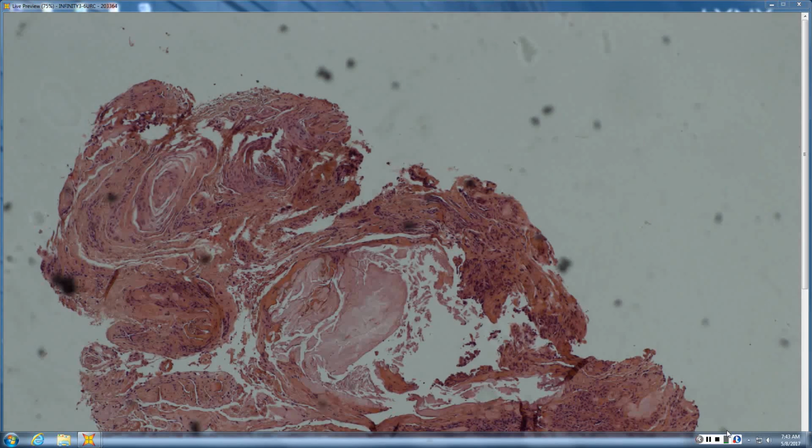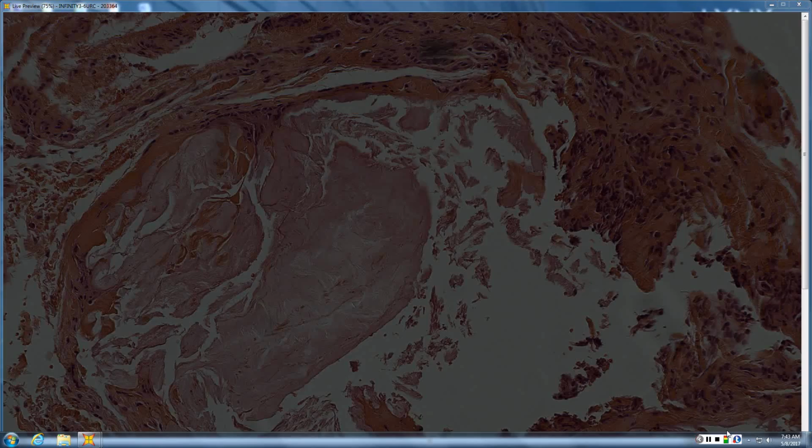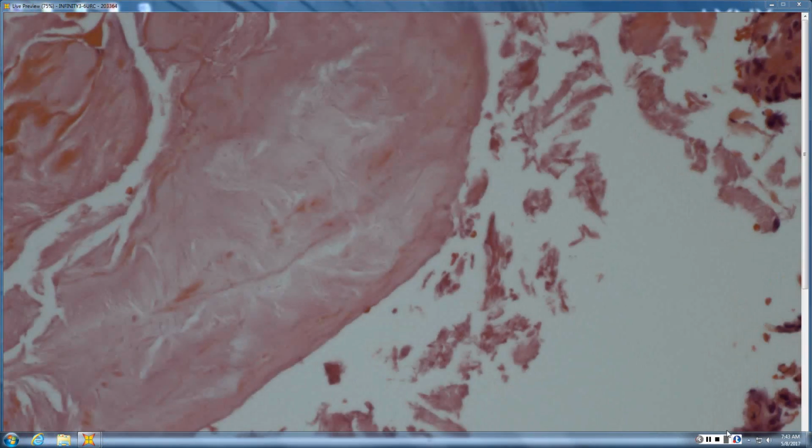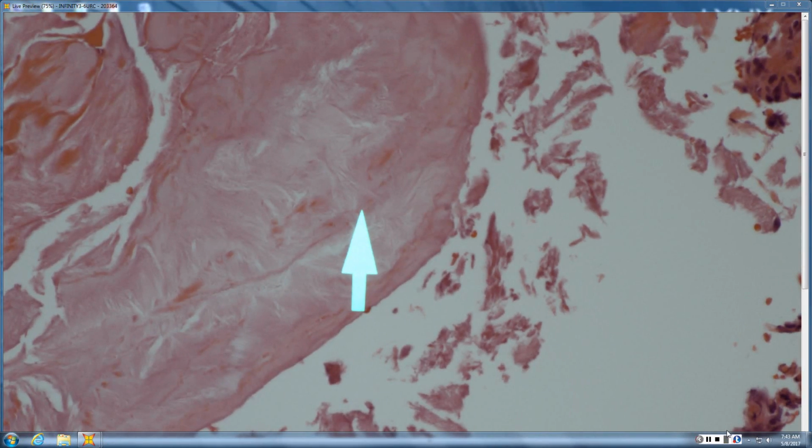This one almost looks like, can't quite tell if that's like gout or early. Yeah, there's certainly something deposited there, right? So we can look a little bit higher, looking at the pattern of the crystals. Feathery. Yeah, that's pretty feathery, so that's good for gout. Great spot.